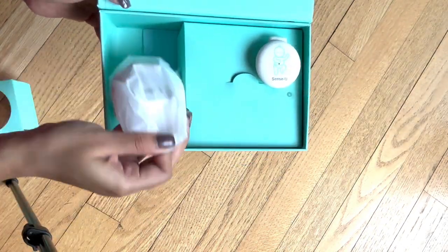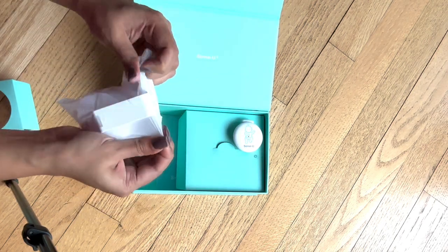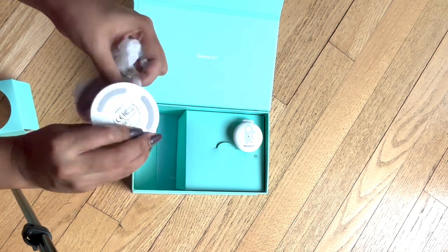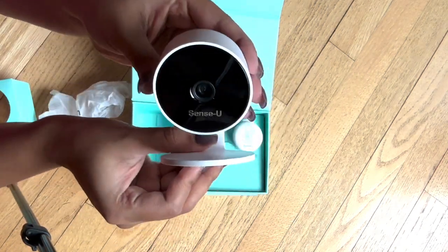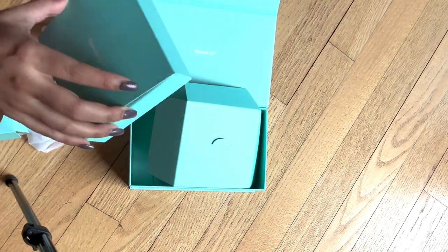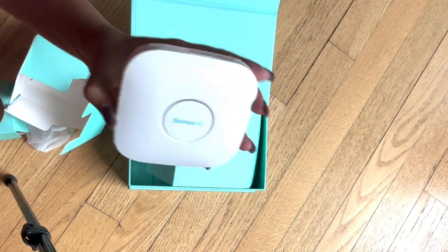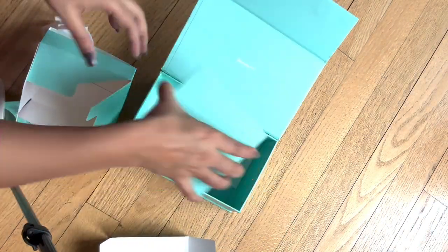This is the baby monitor that monitors your baby's movement and rollover and alerts you. This is the HD camera — what I love about this camera is it's very flexible, you can put it anywhere around the crib, and it comes with a double-sided tape so you can just tape it onto any area. And this is the base station — I will tell you what it does later.